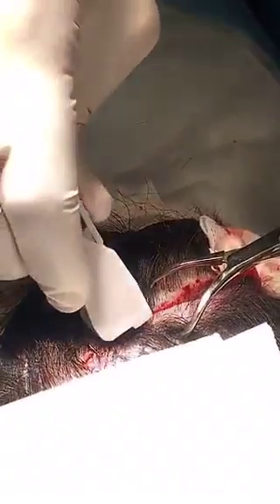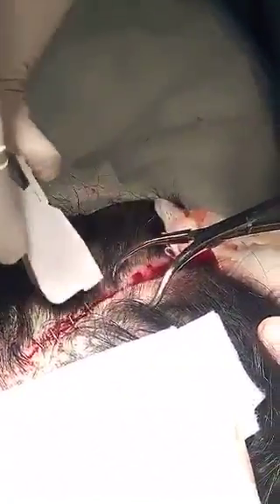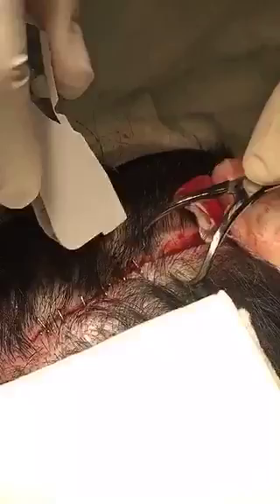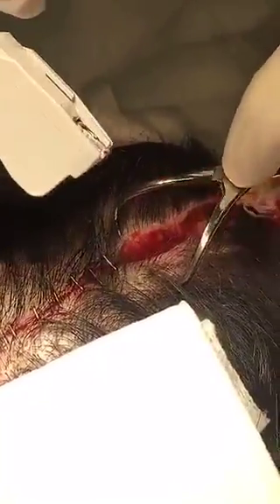With staples in most cases. The scalp closure with staples has the advantage of not having the suture marks, the road signs that sometimes you see on old scars. You don't want to have any of those here.